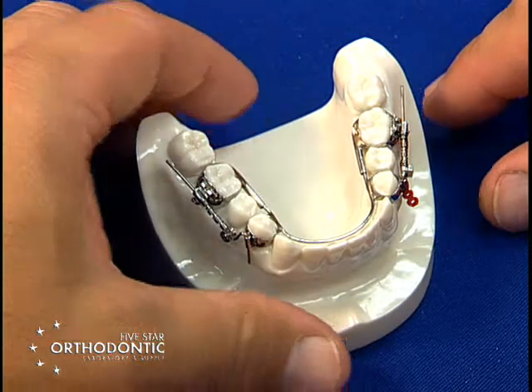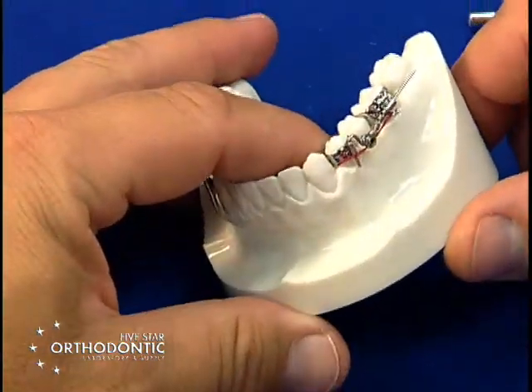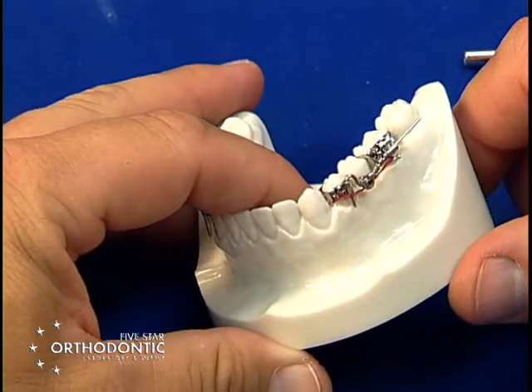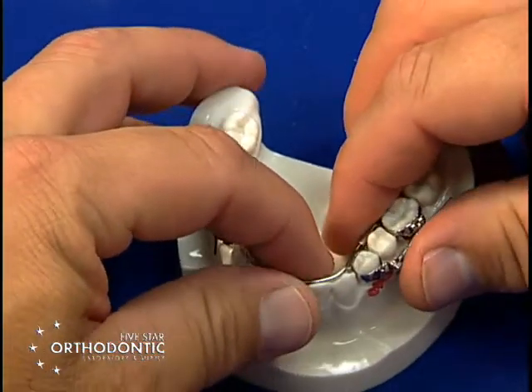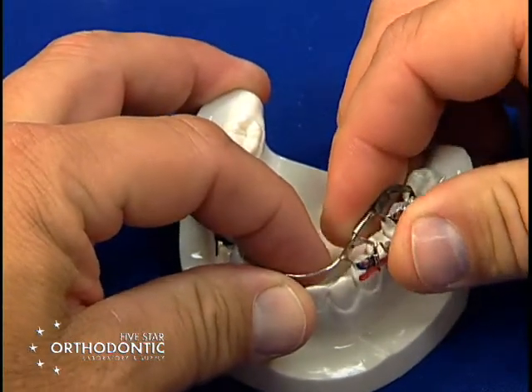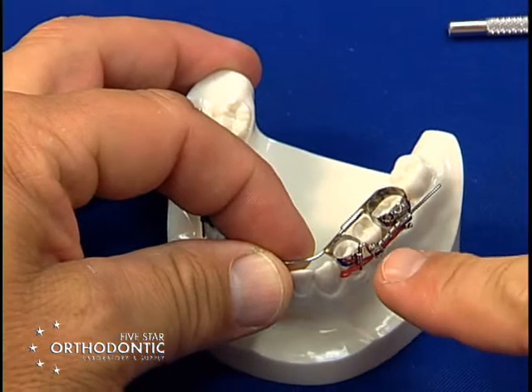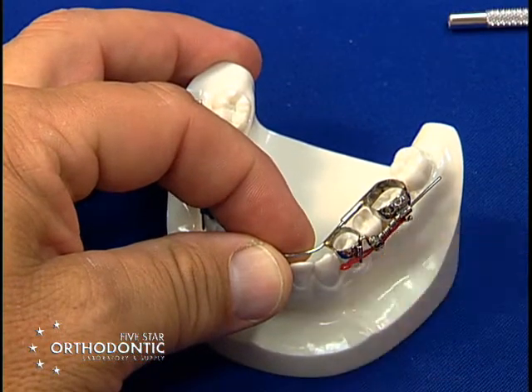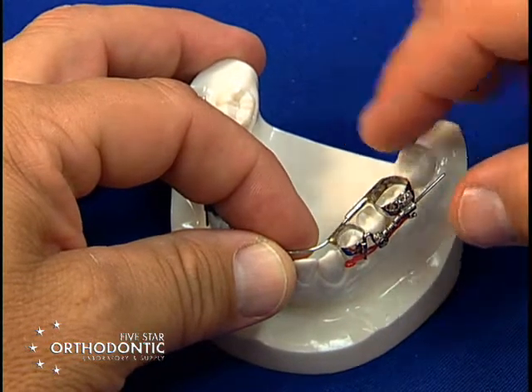Delivering the appliance, make sure you place your separators 3 days to a week ahead of time. And you can place this appliance in all at once. That's what the chain elastic is for, to hold the appliance together. Basically, this is in a position of passive state. Make sure that the lock is not compressing the spring, and the chain elastic will hold the appliance together.